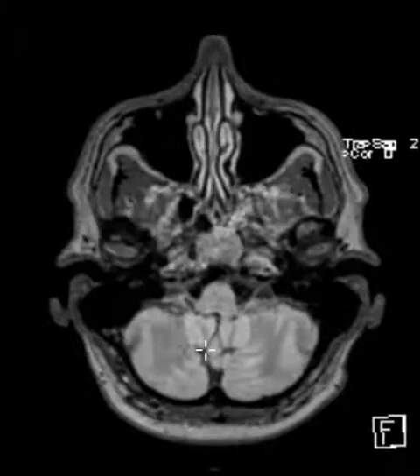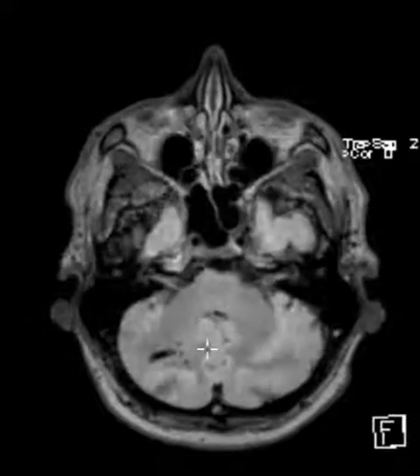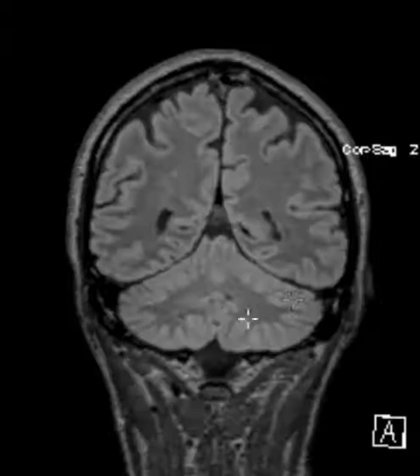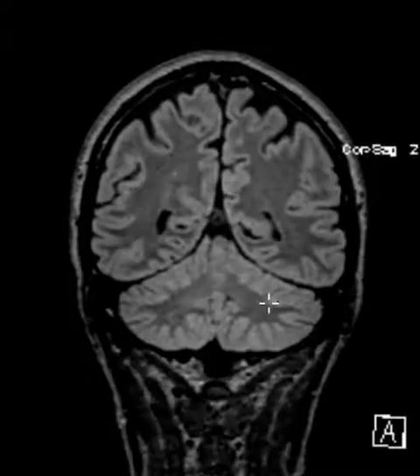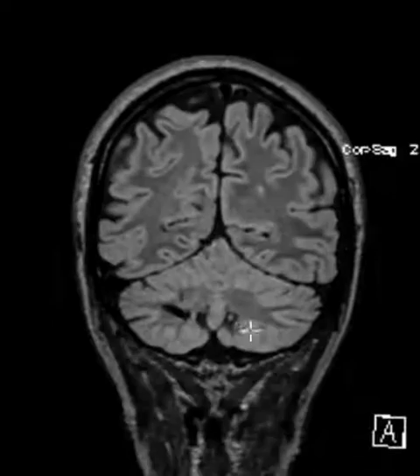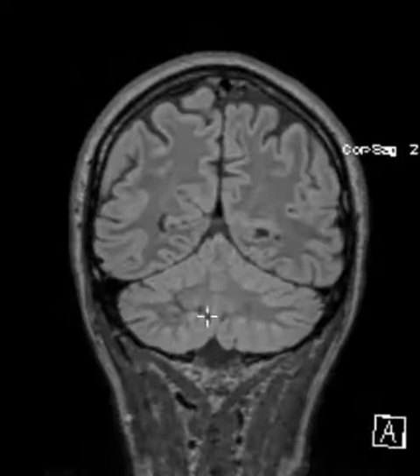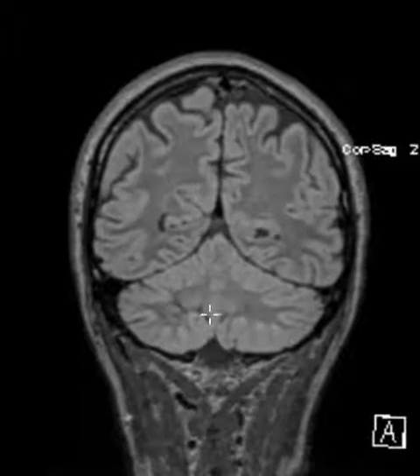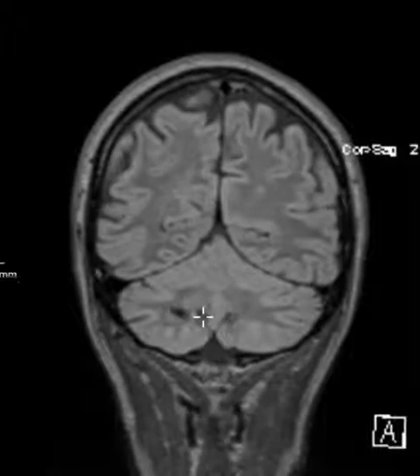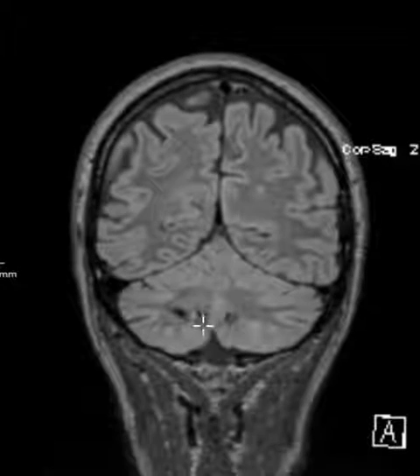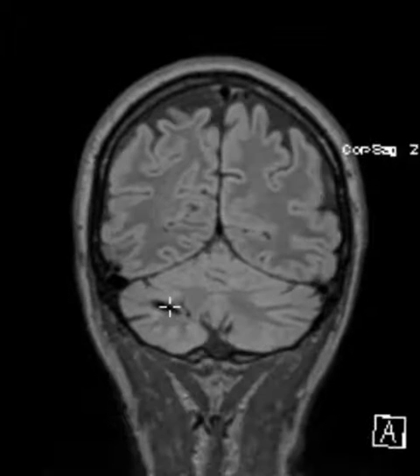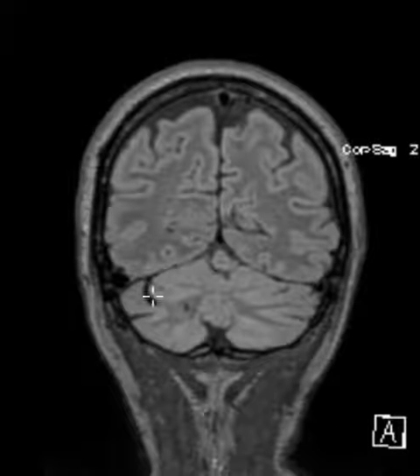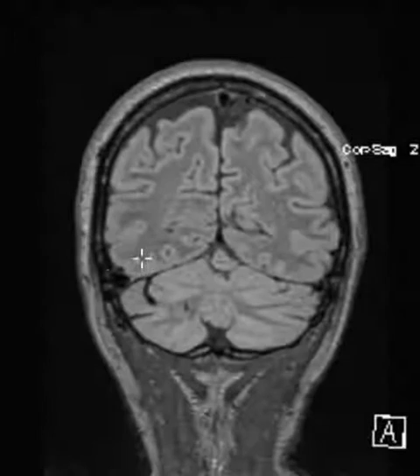When there are pure venous anomalies like this, they're typically asymptomatic and we just make note of them. Here's what it looks like on a coronal view — here's the kaput medusa coming together, these small vessels converging, and here's that dominant vessel going up over here to a dural vein.